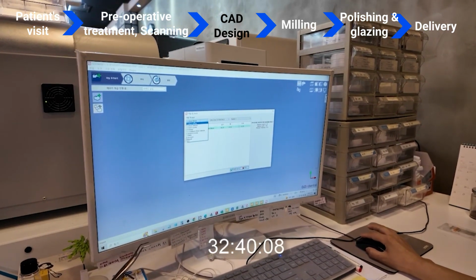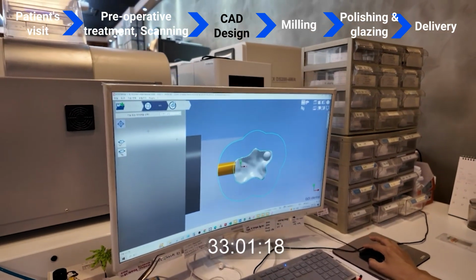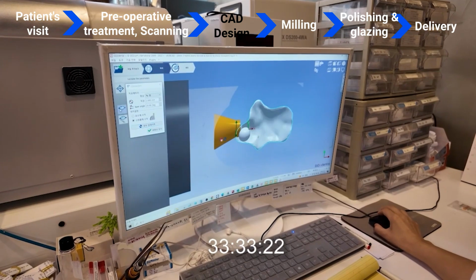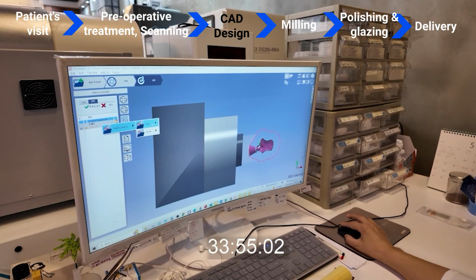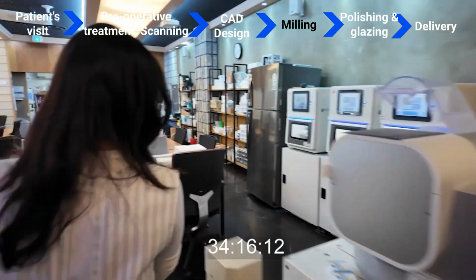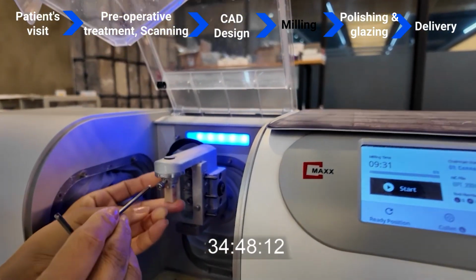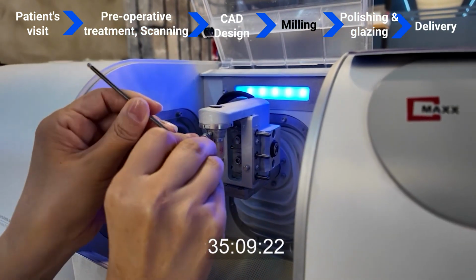Over at the mill, we choose a block that matches the size and material needed for the inlay. After positioning the designed inlay in the software, we connect it to the block with connectors and start the mill. The process is automated, and the inlay is precisely carved out.